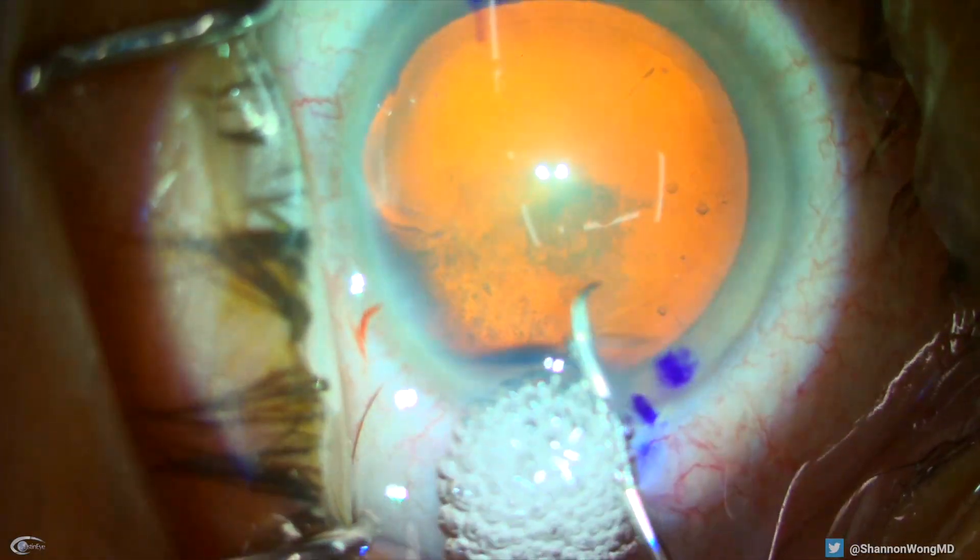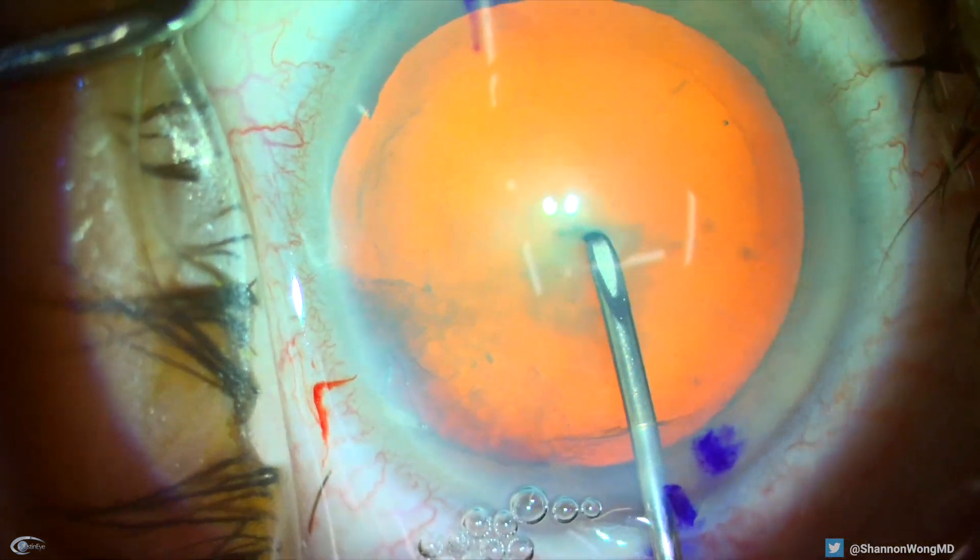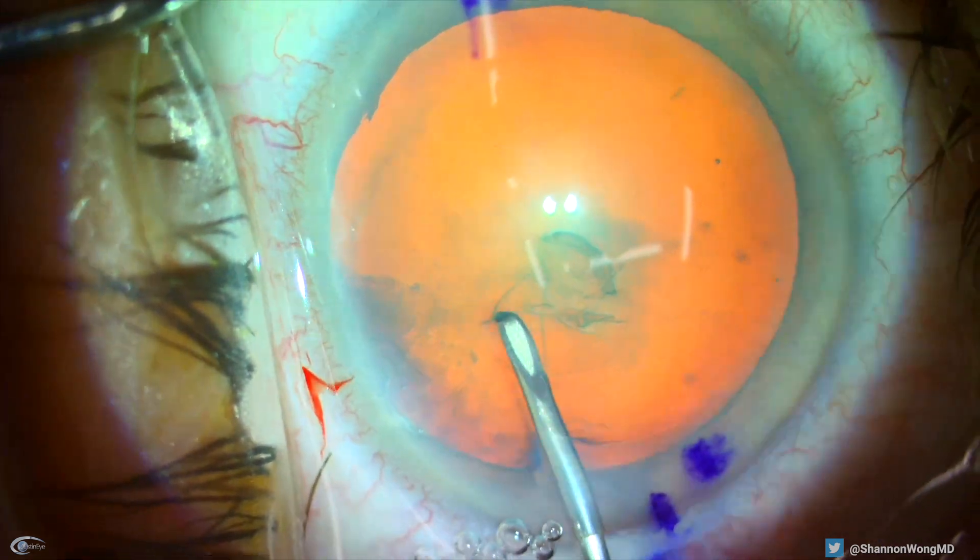I broke the posterior capsule on this case involving a 58-year-old patient who wanted the panoptics lens to see far and near without glasses.